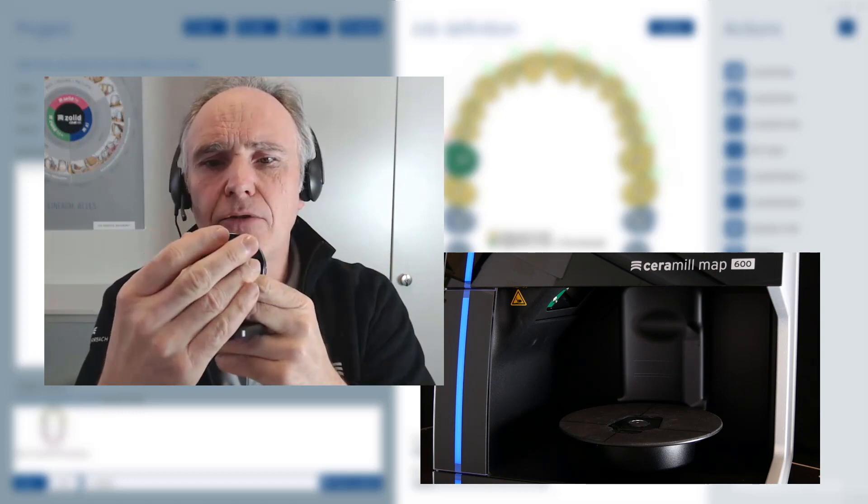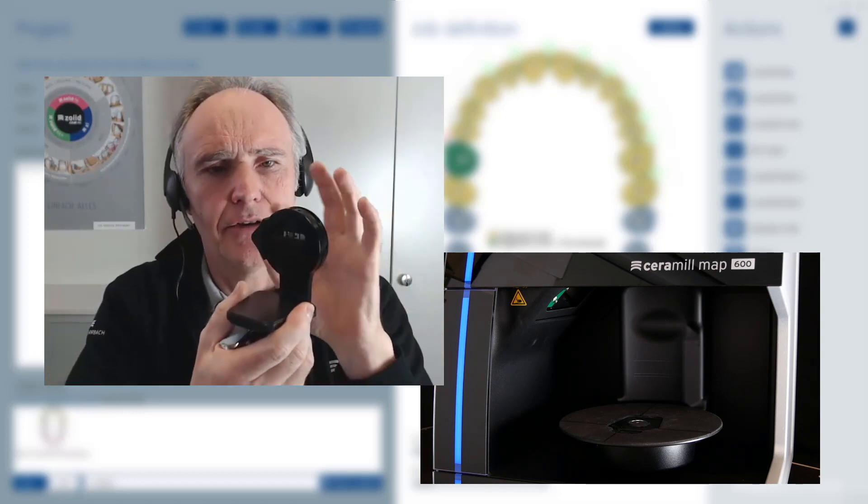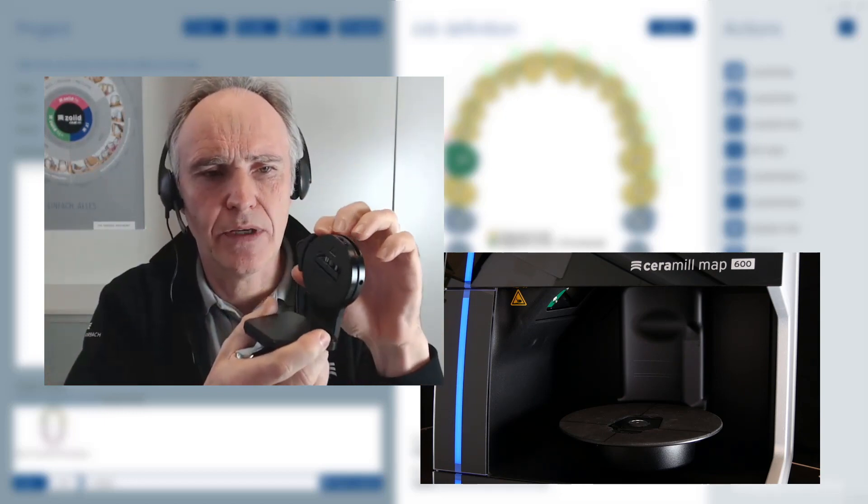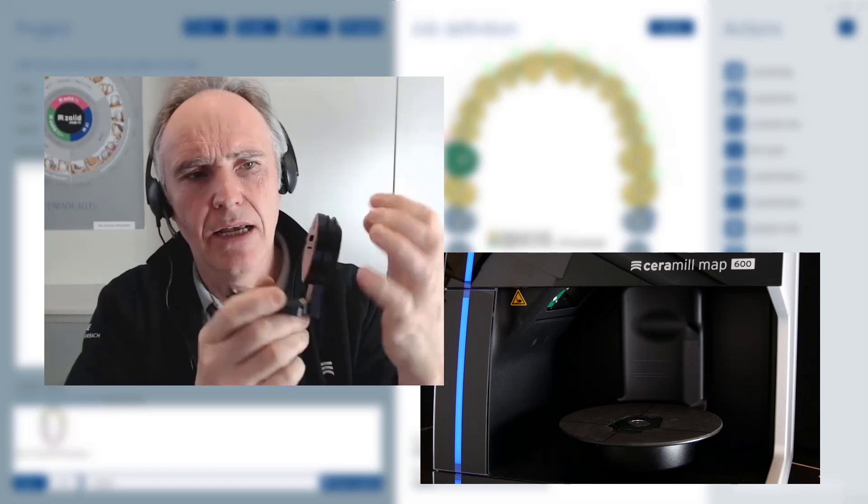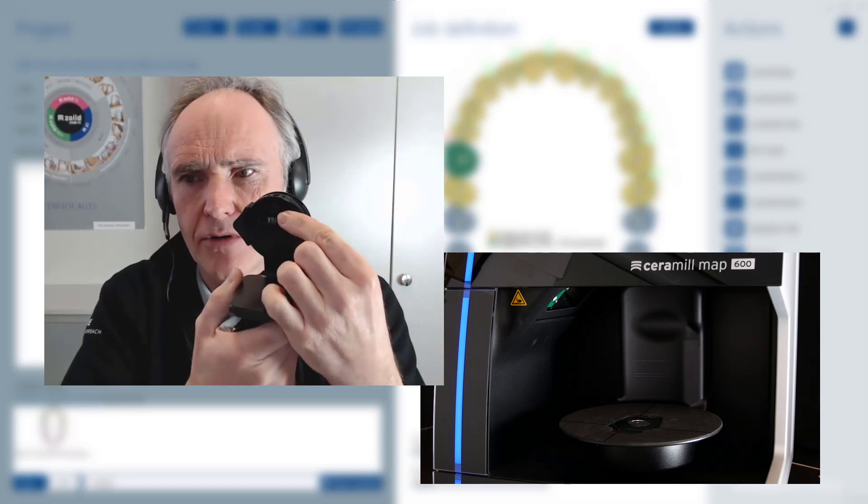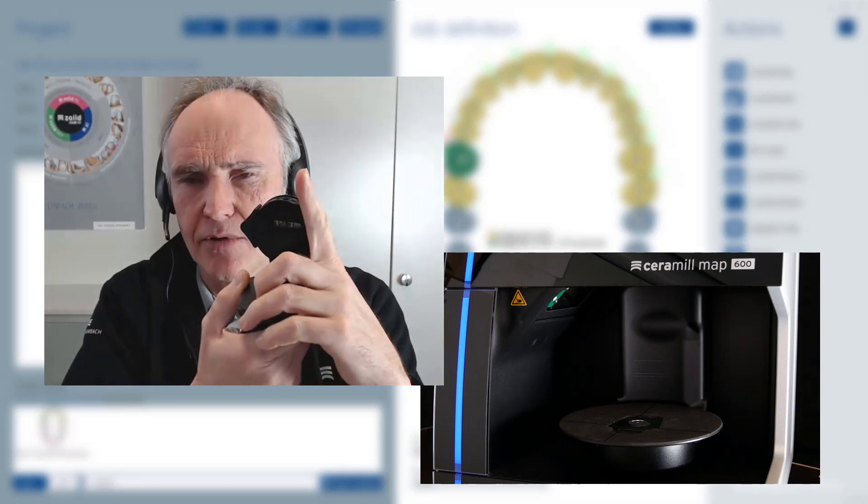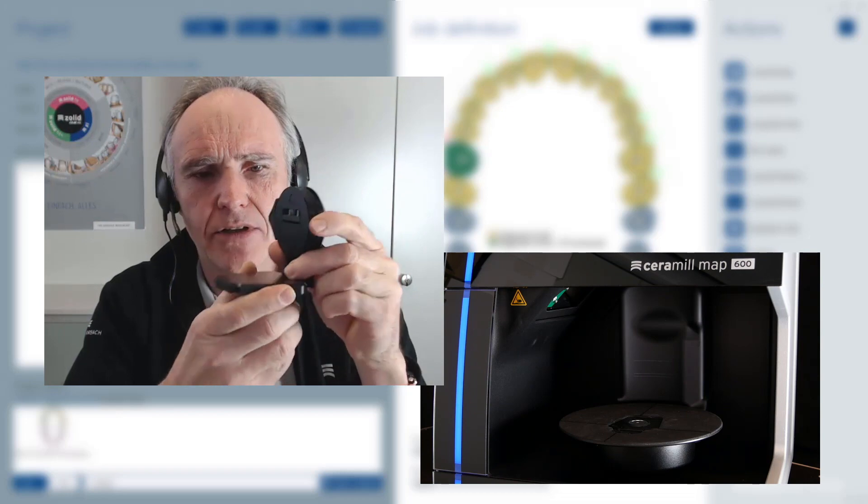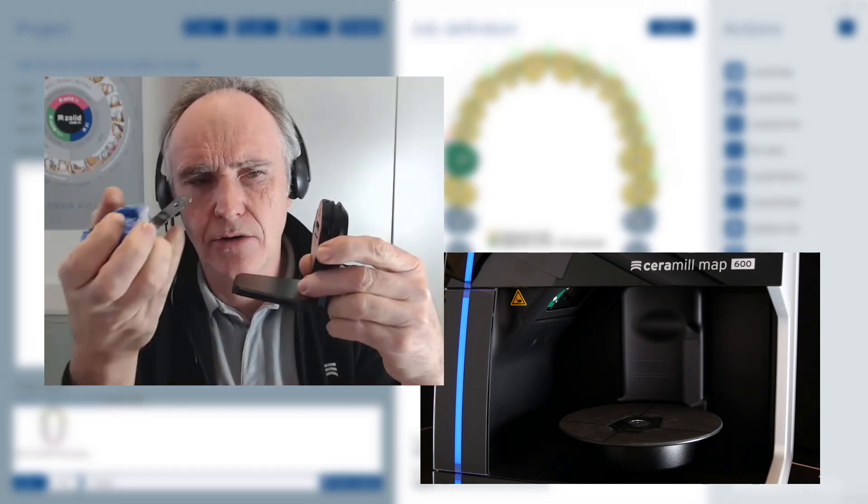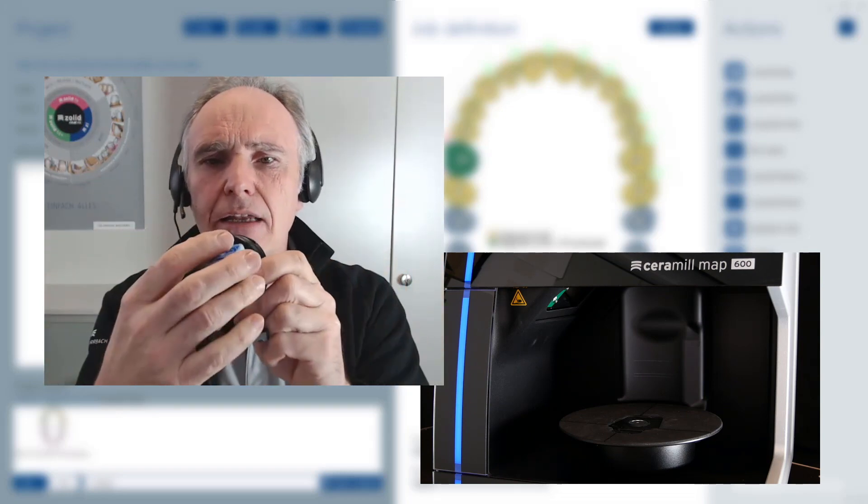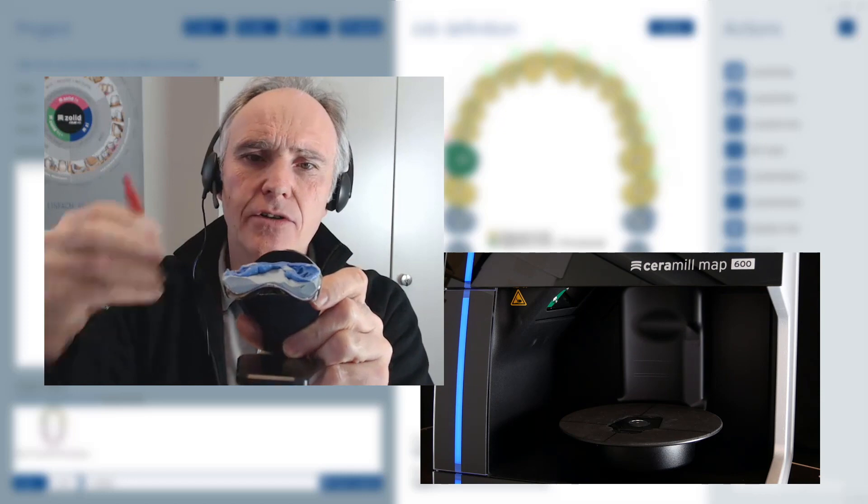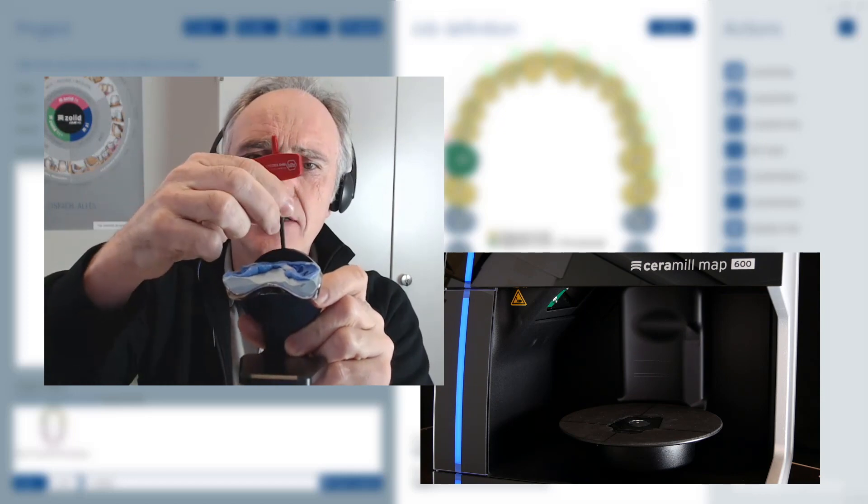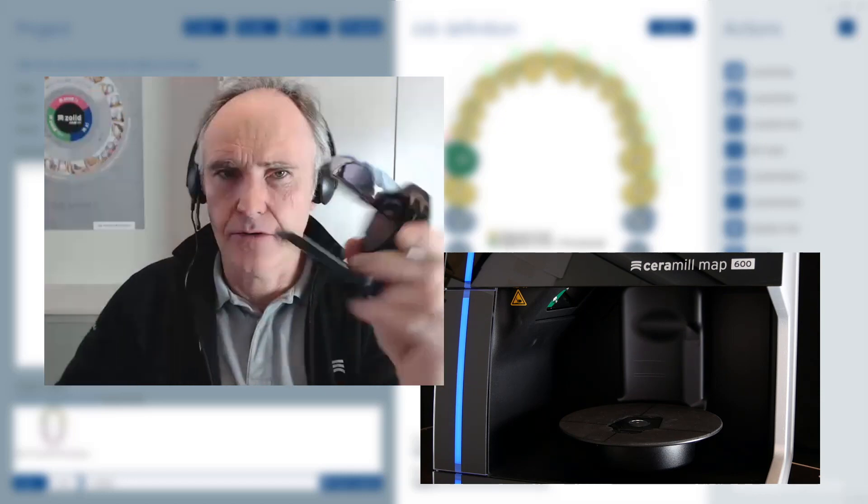For preparing, you see here this holder has to be locked in a final position. Watch that the arrow is pointing up to top, and now it's fixed. Now you take your impression, you put it inside here, and you screw it with the allen screw to fix it and bring it in the scanner.